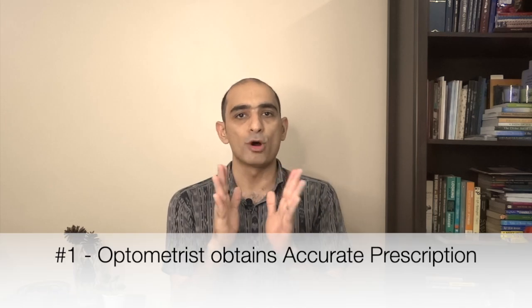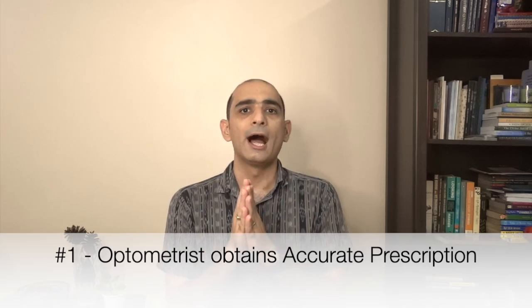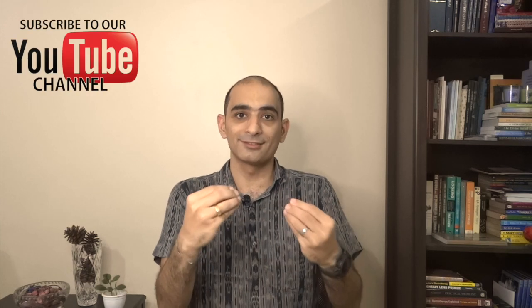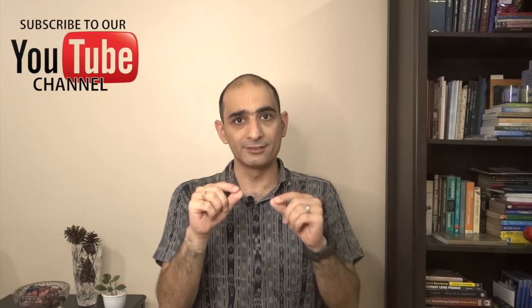The first step is to obtain the patient's prescription and measurements such as pupillary distance, height and angle of wear. This information is used to design a custom progressive lens that fits the patient's needs and visual requirements.